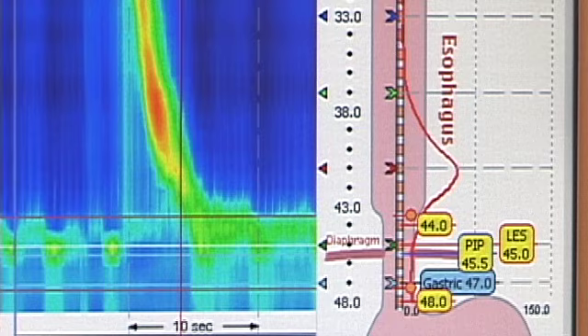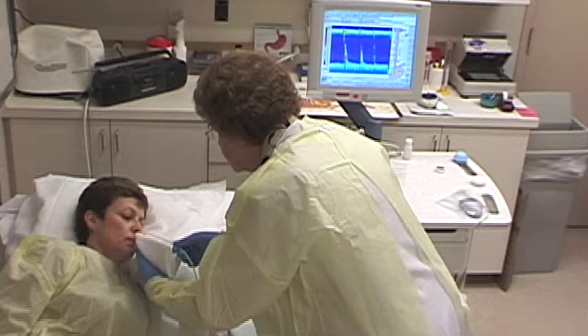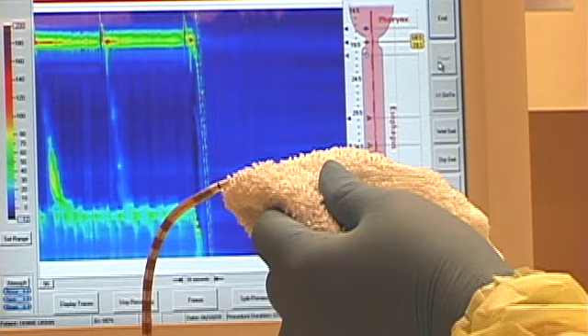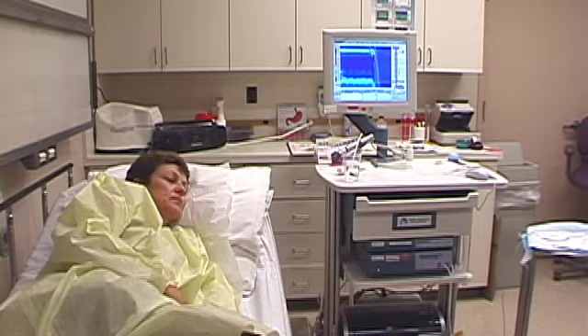The computer charts the pressure of the sphincter muscle and the contraction waves of swallowing. Multiple swallows are taken to allow measurement of various parts of the esophagus. The physician can later evaluate these wave patterns to determine if they are normal or abnormal and take appropriate action. With the pressure recordings finished, the tube is withdrawn and a thermal compensation reading is taken to complete the study.